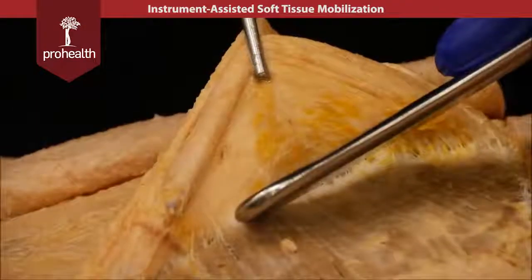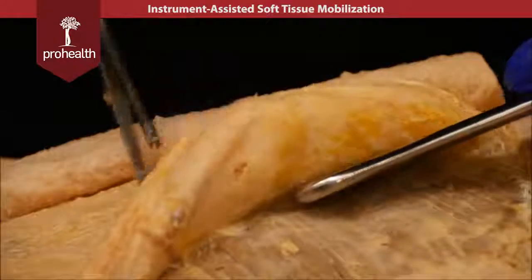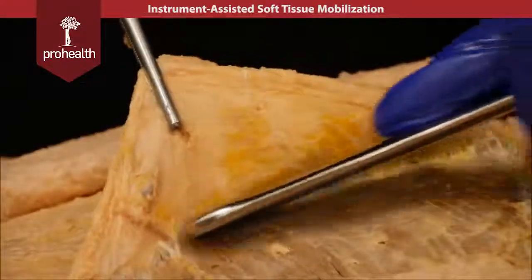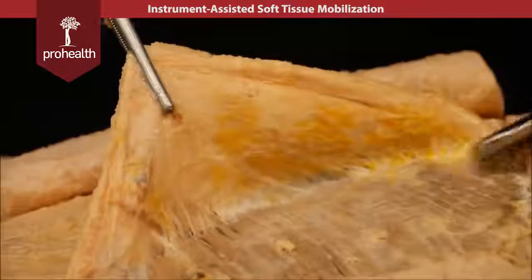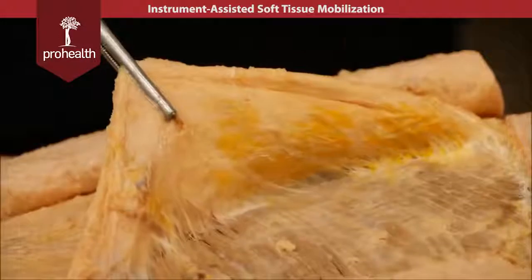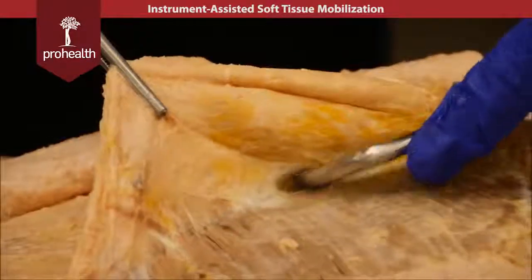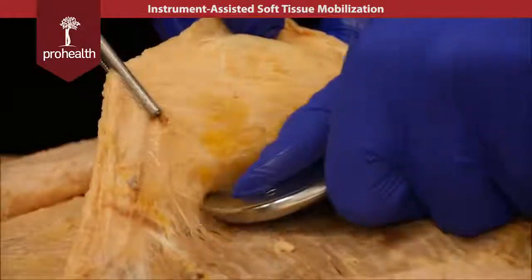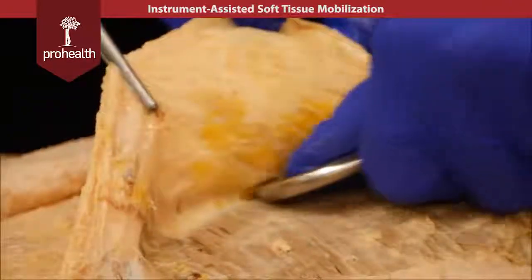Here we have a cadaver demonstration of some instrument-assisted techniques working on the superficial fascia. On the lower part of your screen, what you're looking at is actually the muscle. On the upper part of the screen, you're seeing the superficial fascia being reflected back. And if you look really closely at the junction between those two structures, you're able to visualize the superficial fascia and deep fascial connection right there. With various techniques and movements in different regions of the body, you're able to release different forms of scar tissue and adhesion that will improve overall function in this region.